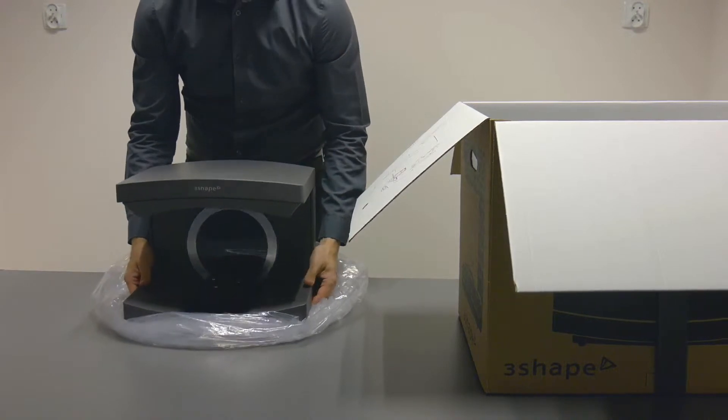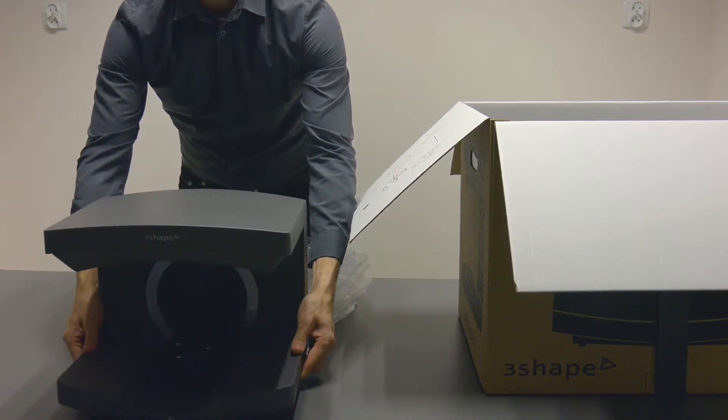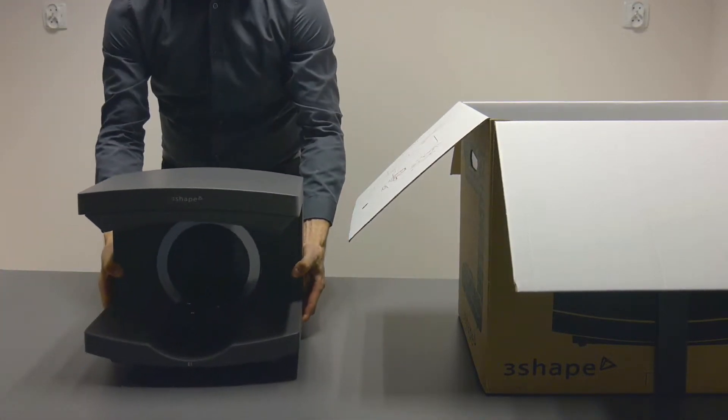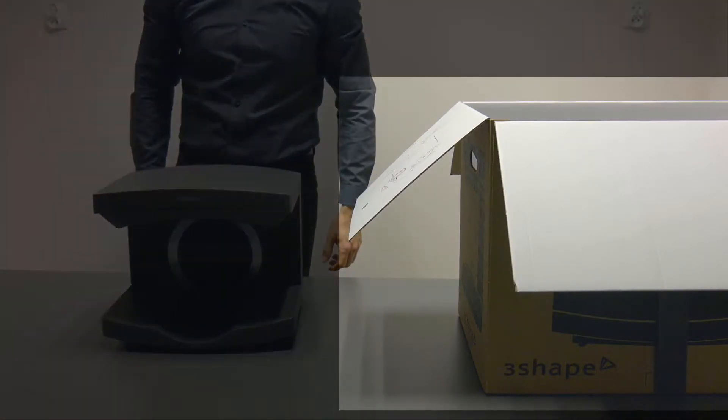When you move the scanner, always lift it from underneath, with the top of the unit facing up and the back of the unit facing you. We recommend that you keep the packaging in a safe place, in case the scanner needs to be transported in the future.